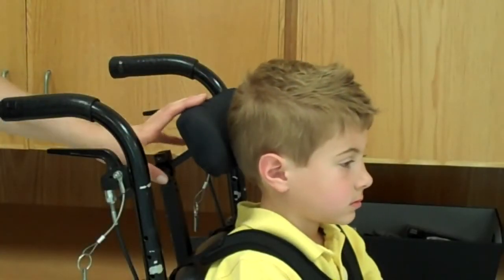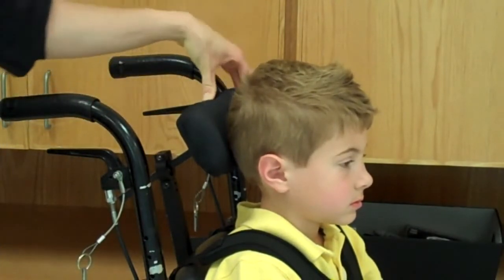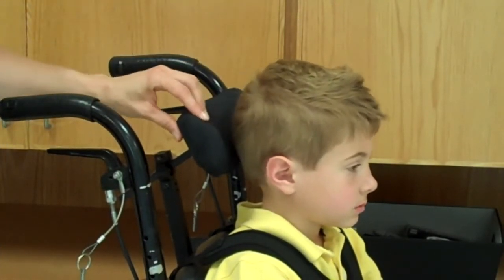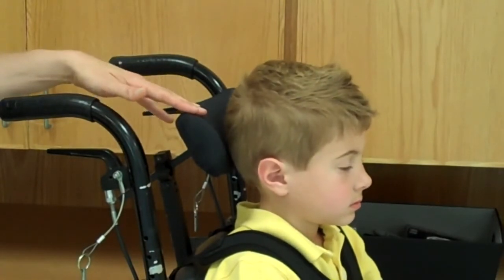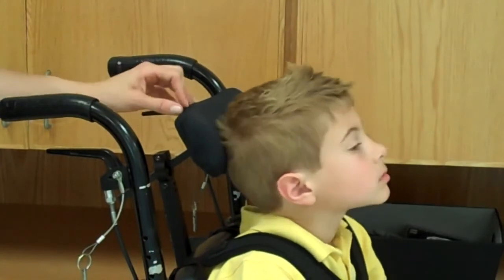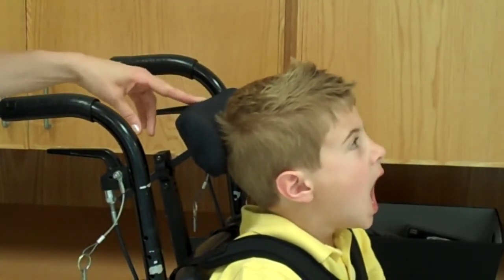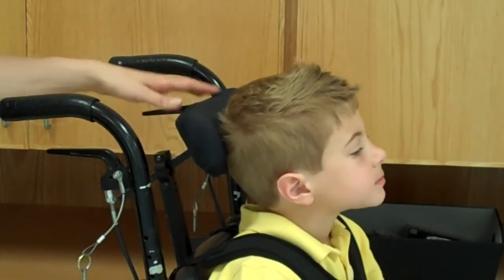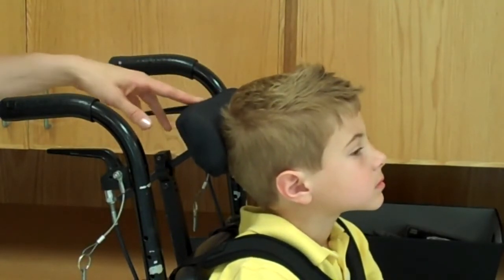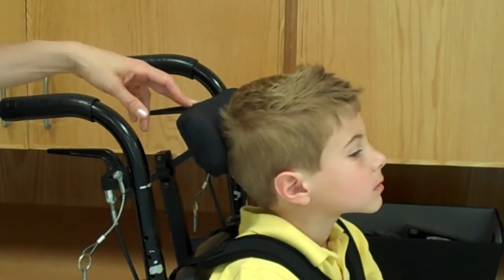This is the headrest. Headrests can be all different shapes and sizes depending on the student's head control and their ability to keep their head upright. The headrest typically stays in a set position. If you notice that it is moving, you can contact your school-assigned physical therapist to assist in repositioning and tightening it. This is especially important for our students with poor head control who ride the bus. If a headrest is significantly loose, then it will need to be adjusted before they ride home on the bus.